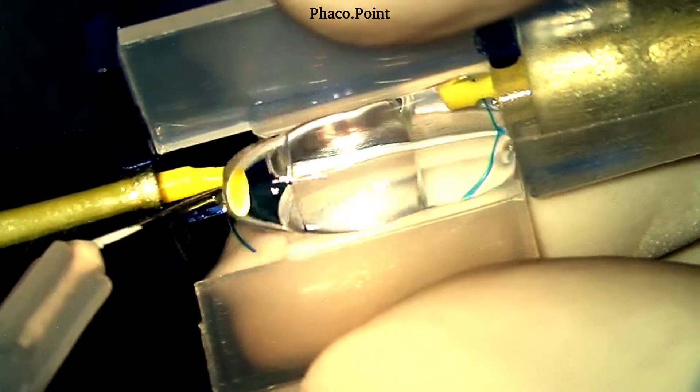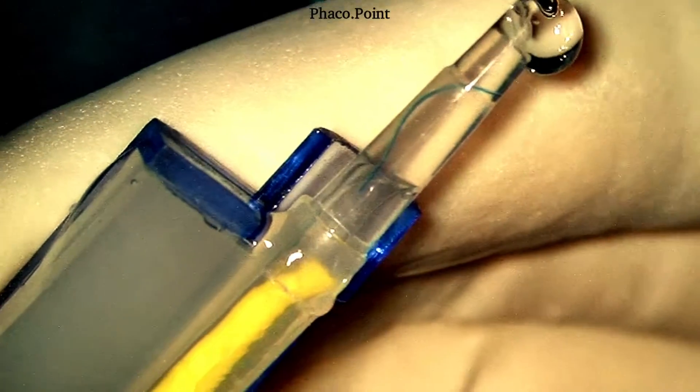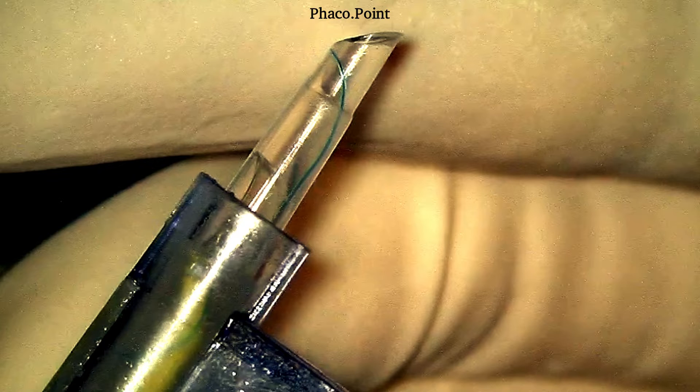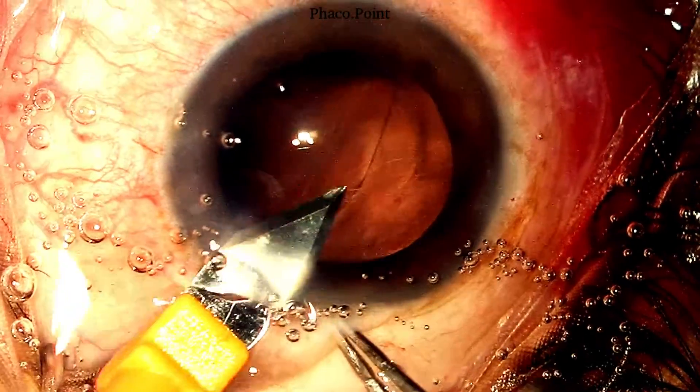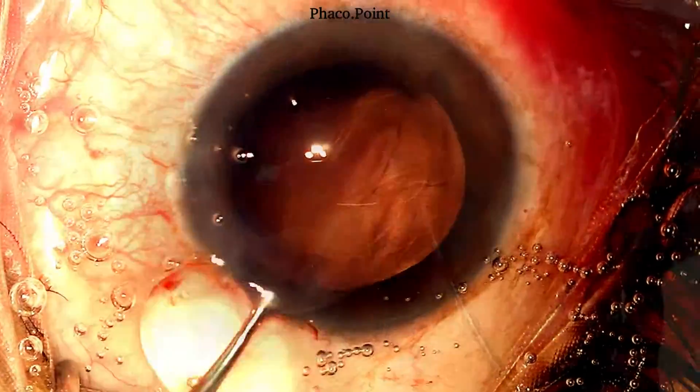We now proceed to loading and insertion of the three-piece IOL in the ciliary sulcus. It is loaded optimally. Under direct visualization under the microscope, the leading haptic is brought forward close to the tip. It is important to visualize the position of the anterior tip of the leading haptic — this helps you understand the manner in which you need to rotate the cartridge prior to injection so that it comes out in the correct position over the anterior capsular edge inferiorly. Adequate dispersive viscoelastic is introduced, the main incision enlarged to 3.2 mm, and then the IOL is inserted.